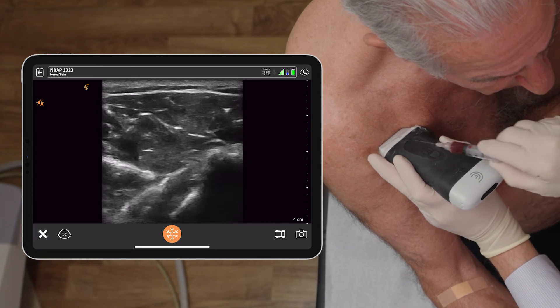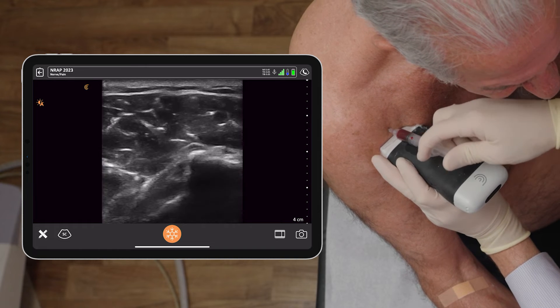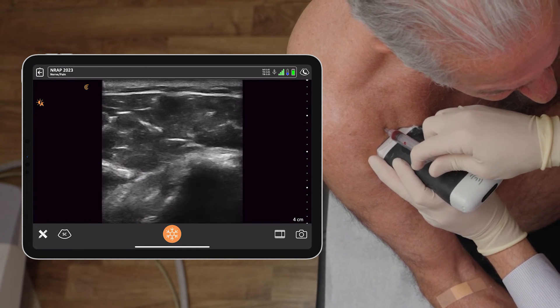All right, a little pinch. Taking the out-of-plane approach, you can see the injection going into the glenohumeral joint.